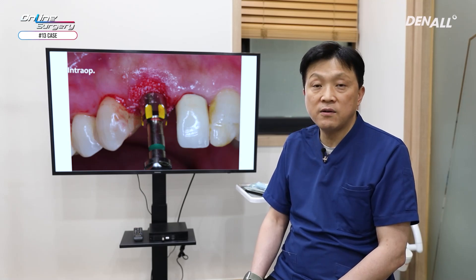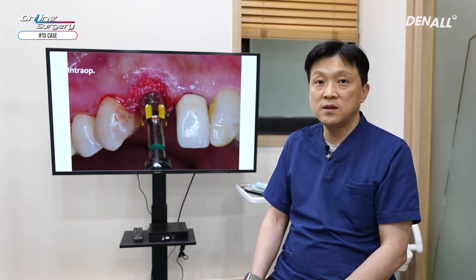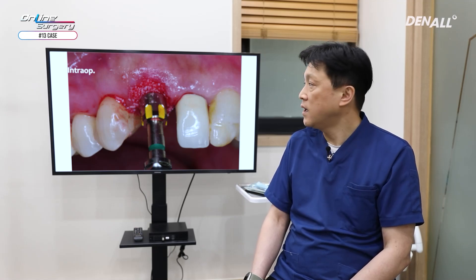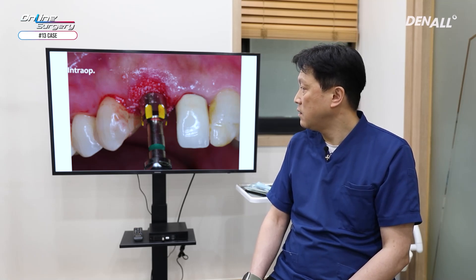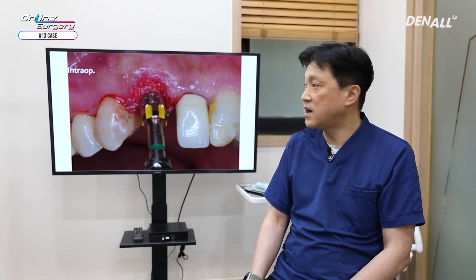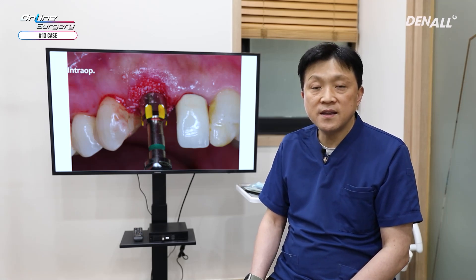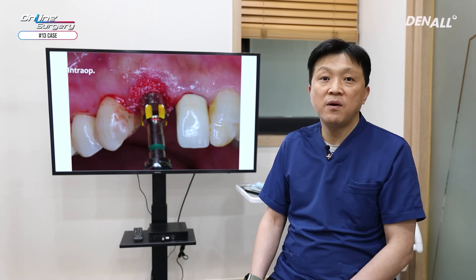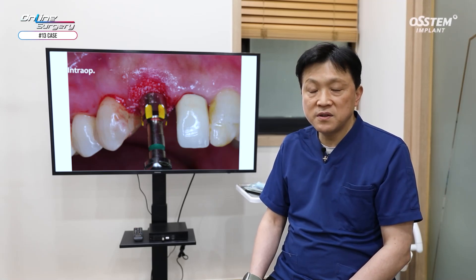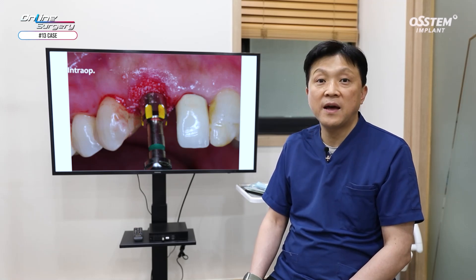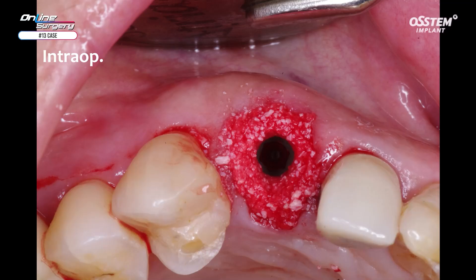When performing a dual zone graft, placing a healing abutment first can cause difficulties in introducing graft material due to its wide diameter. Therefore, with the implant driver still on, the bone graft material was placed. When using AOS collagen, the collagen graft material has self-aggregation properties, which prevents scattering of the graft material. After removal of the implant driver, graft was done up to the gingival area.